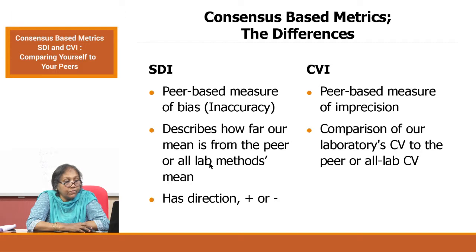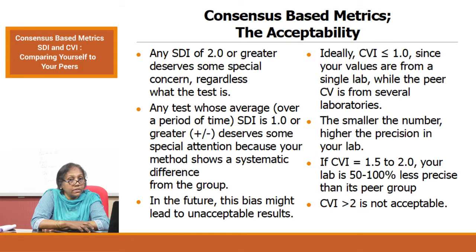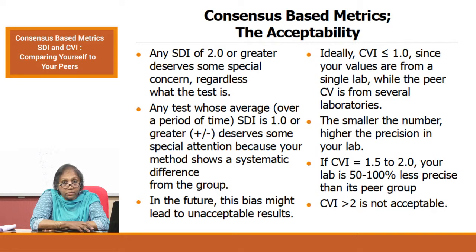SDI describes how far your mean is from the peer or all-labs mean; CVI compares your lab's CV to all peer labs' CV. SDI has direction — plus or minus — and any SDI of 2 or greater deserves special concern regardless of the test. Any test whose average SDI is 1 or greater in one direction over time deserves attention, as it shows a systematic difference from the group and may lead to unacceptable results. CVI should ideally be less than 1; CVI of 1.5 to 2 means 50 to 100 percent less precise than peers, and CVI more than 2 is not acceptable.